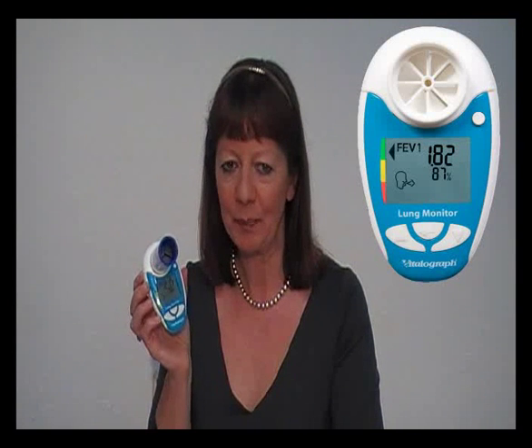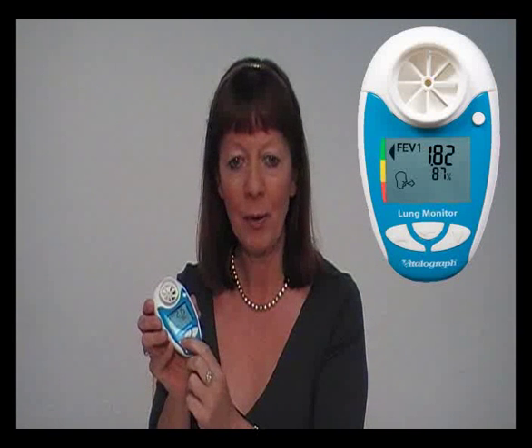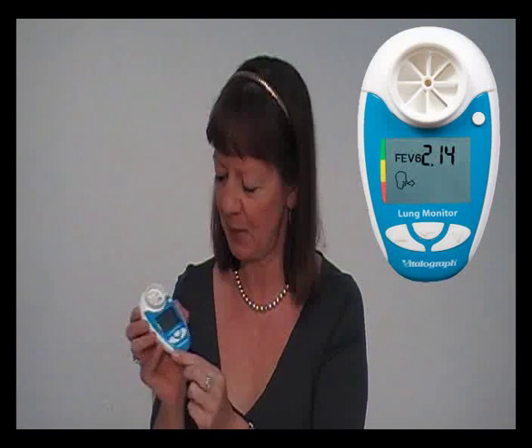The FEV1 measurement will be displayed on the screen. Press the middle enter button to display the best values from the 3 tests. Press the up arrow to view the FEV6 measurement, and press the up arrow again to view the ratio.